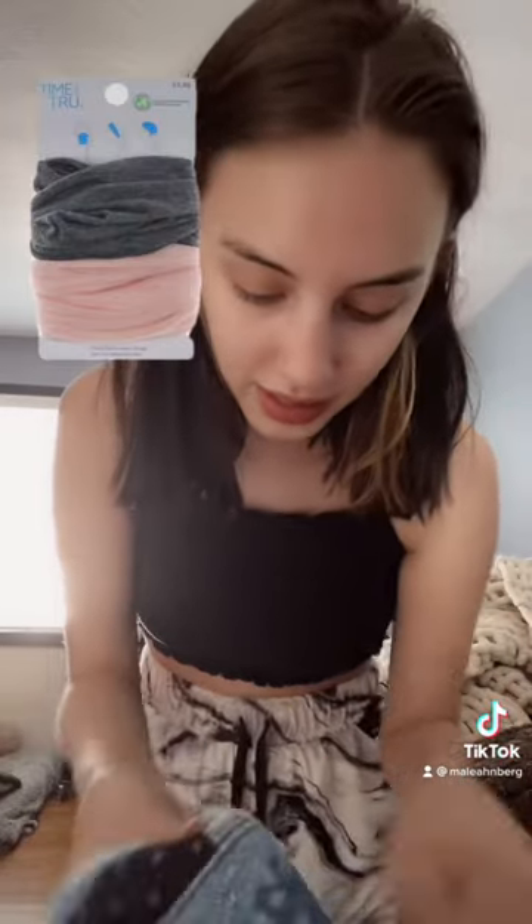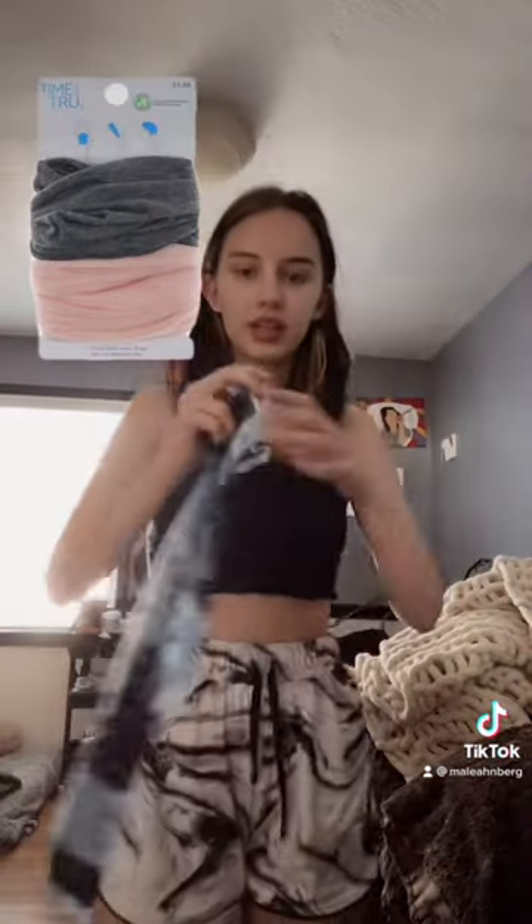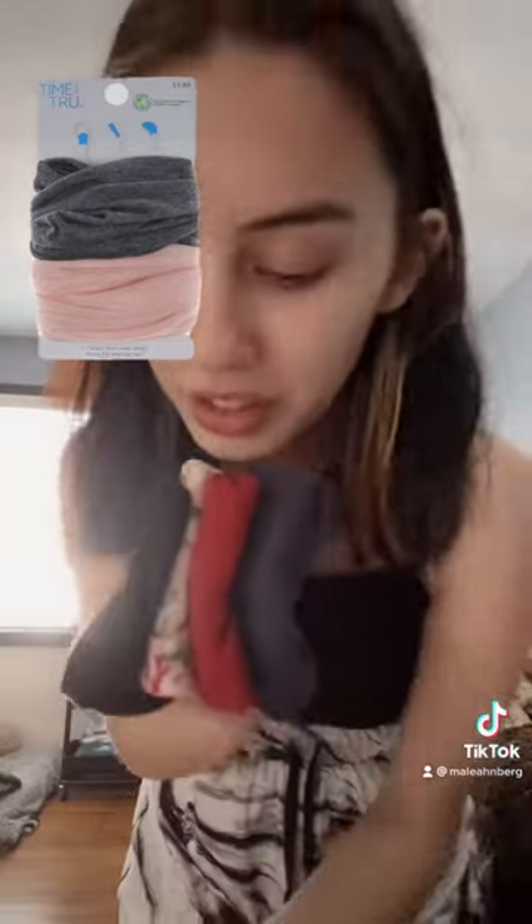I've literally been waiting for someone to ask this because I just want to show it off — it's so fun! You can get these long headband things from Walmart for like three dollars, and they come in a bunch of different colors and patterns. That is what I use to cover my C-collar.